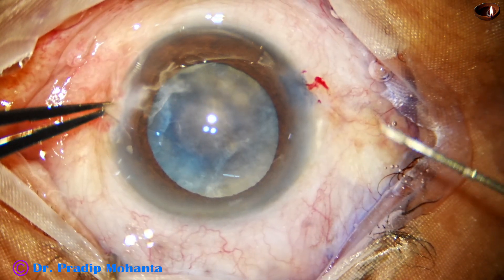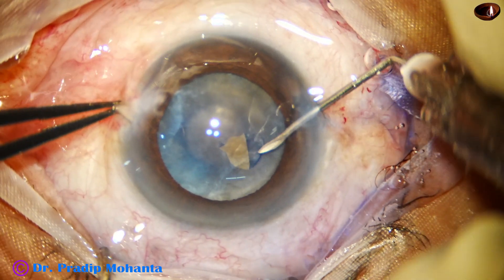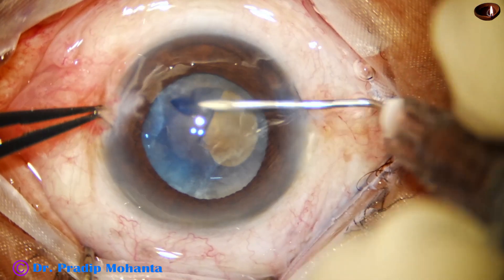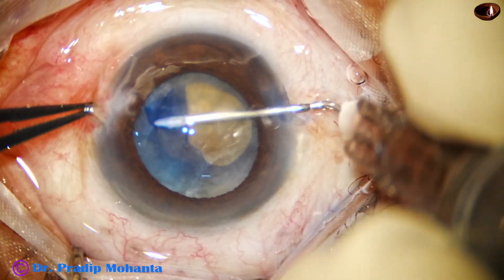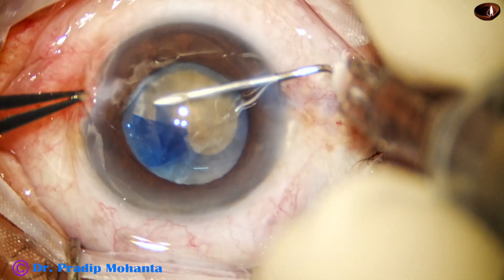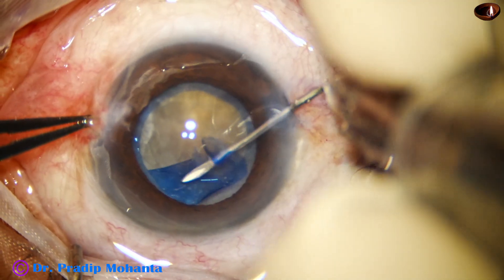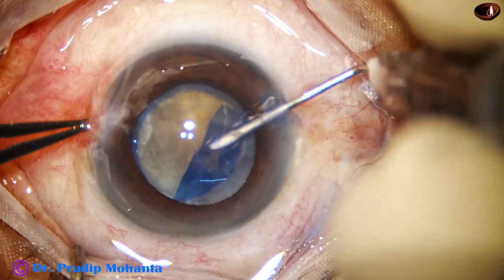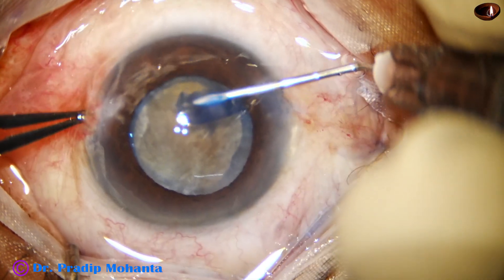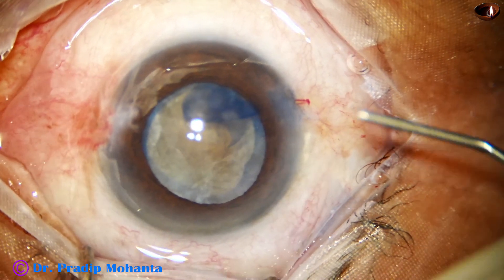I usually do the rhexis with Utrata forceps, but in this case I am trying with a needle. I have used a needle for a long time before resorting to Utrata forceps, so I know how to do rhexis with a cystotome. My plan is to do the rhexis, wash some cortical lens matter, and see how hard the nucleus is. Capsulorhexis is done — it's a large rhexis, good for both FACO and SICS.